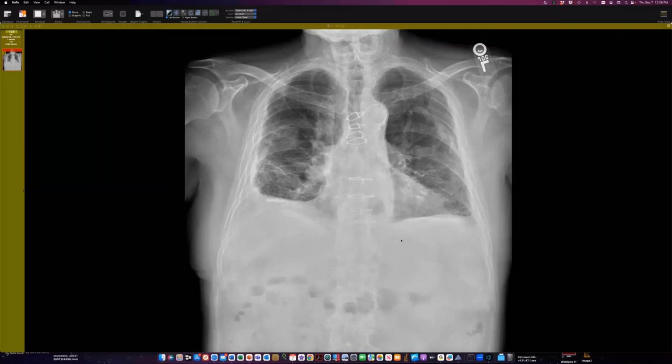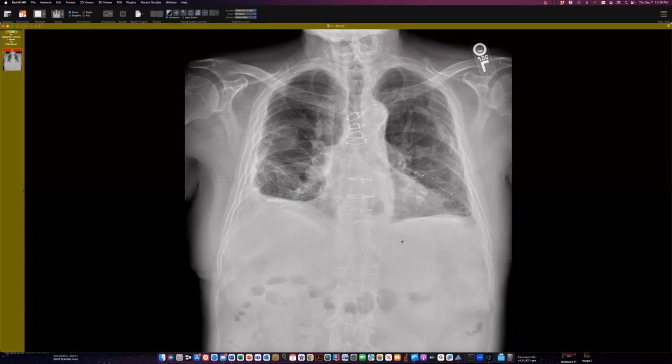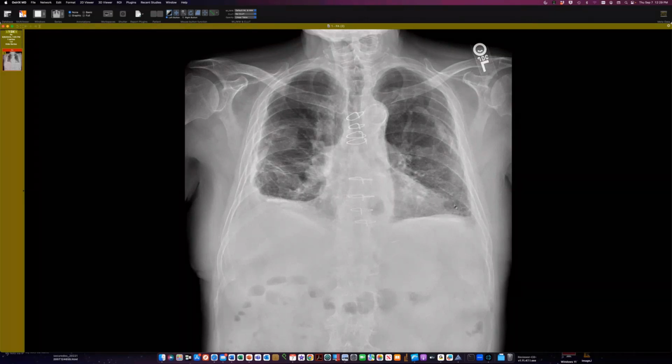Can we see a chest roentgenogram? Okay, I wanted to show you guys this case because this is a fairly unusual manifestation of asbestos exposure, and that is diffuse pleural thickening. And it's always confusing because diffuse pleural thickening has so many other causes, including, as this person has had, cardiac surgery. But we do have diffuse pleural thickening here that blunts costophrenic angles, unlike plaque, which spares costophrenic angles.